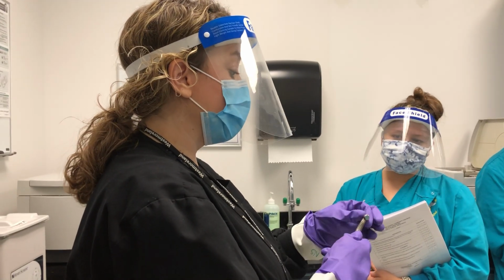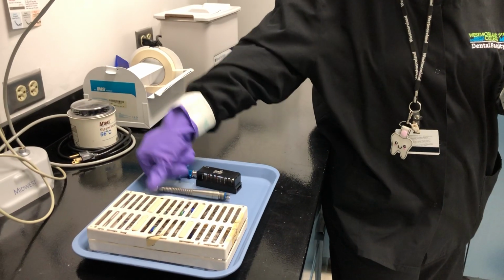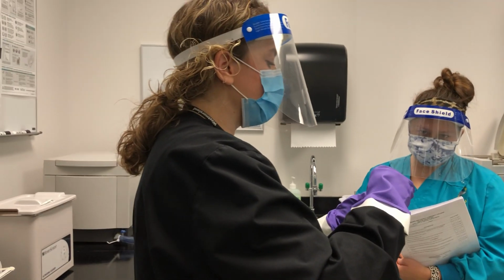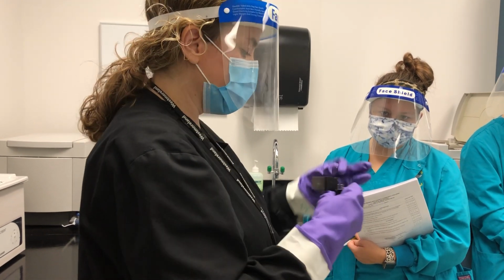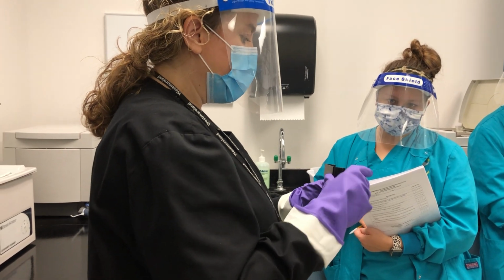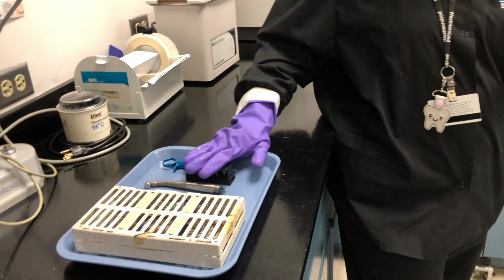Perfect. So yeah, so we're going to go ahead and take it out. And I do have the burr holder right here as well, so I'll set my high speed back down. And everybody can see what these little burr holders look like. Burr blocks. They have little tiny holes that you can put your burrs in for safekeeping. So we're just going to slide our burr back down in there. Okay? And then we're going to close that and put that back on our tray.